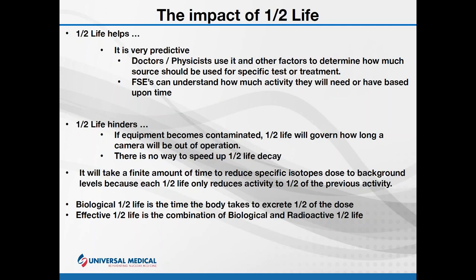But there are some real downsides to half-life, and this is what I want to stress. The downsides to half-life, and this is especially true if a gamma camera or the room in which a gamma camera is located becomes contaminated, the reality of half-life is it takes a finite amount of time for that unwanted activity to reduce to background levels. And there's no way to speed it up. I can try and clean up the radiation, but you will never get it all. You can get some of it, the liquid part you can get, but it absorbs in. You can never get it all. So it has to decay out.